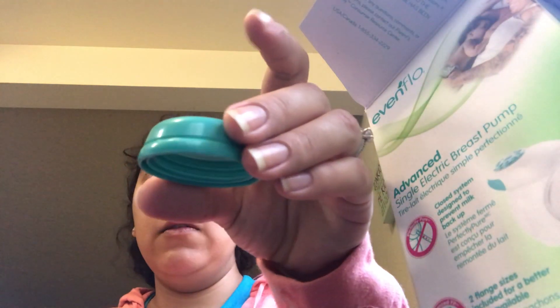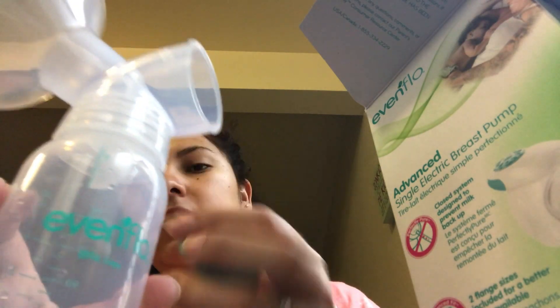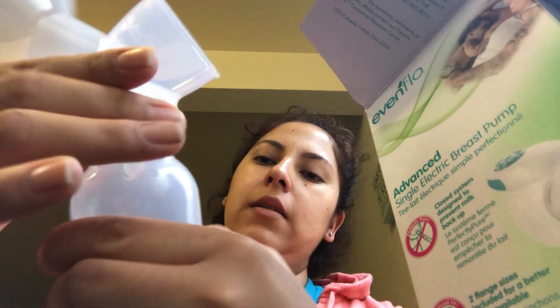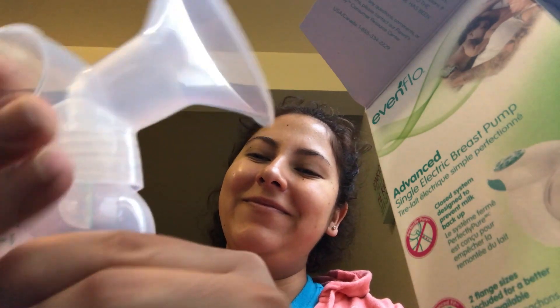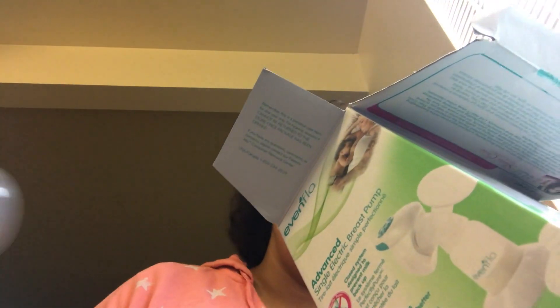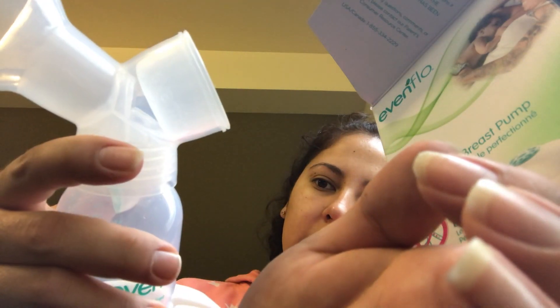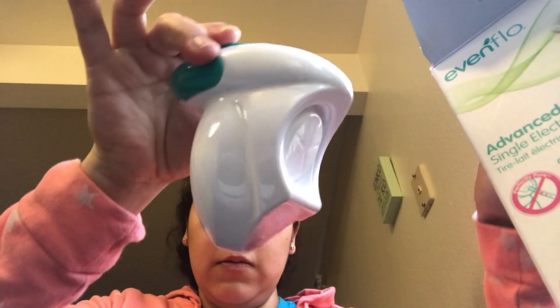It comes with the lid for the cup. Let's say if you're done using your pump and you want to leave your milk in the refrigerator or something — just pop on the lid, and that's it. And then it also comes with this additional plastic piece that you have to put in here, and you just leave it there.